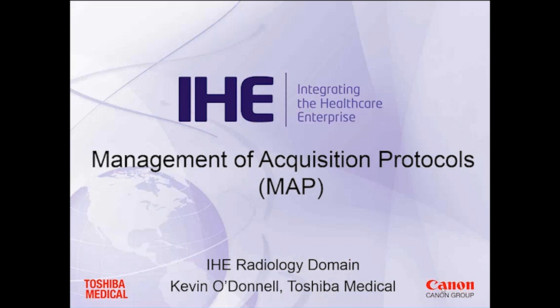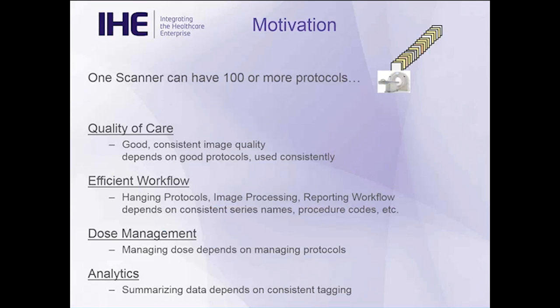Okay, so this profile is called Management of Acquisition Protocols, or MAP. I'm Kevin O'Donnell from Toshiba, who will be presenting. And so the motivation for this one is, on a given CT scanner, one scanner, you may have up to 100 or in some cases even more protocols.